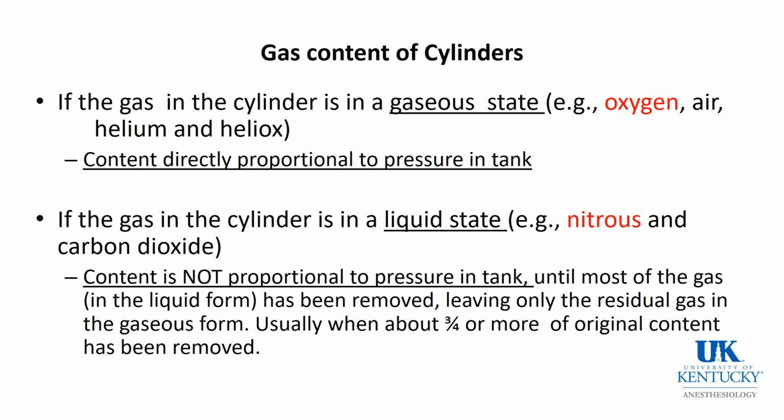On the other hand, if the cylinder is in the liquid state, and this is true of nitrous, the content is not proportional to the pressure in the tank until all of the gas in the tank is in the gaseous form.